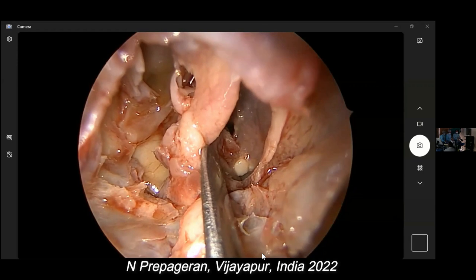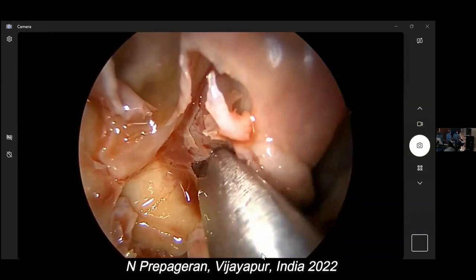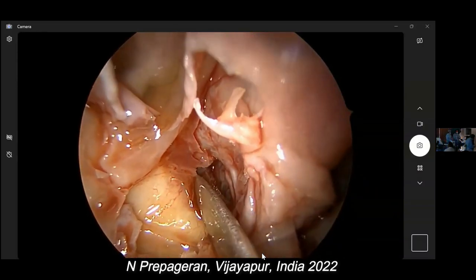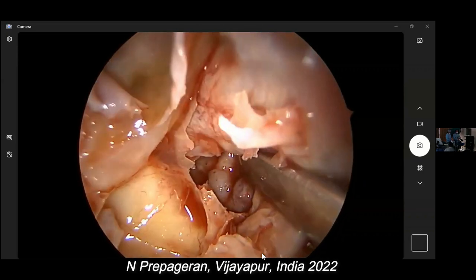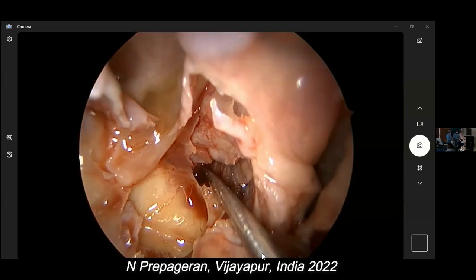So now I'm going to go to gate number four. Remember, the sphenoid ostia, correct? Yes. So when you go through this, always keep medial and inferior. And that will take us straight to the sphenoid sinus here. There, the sphenoid sinus ostia here. Can you see? That's the sphenoid ostia there. Yes, sir. But it's very hard bone there.